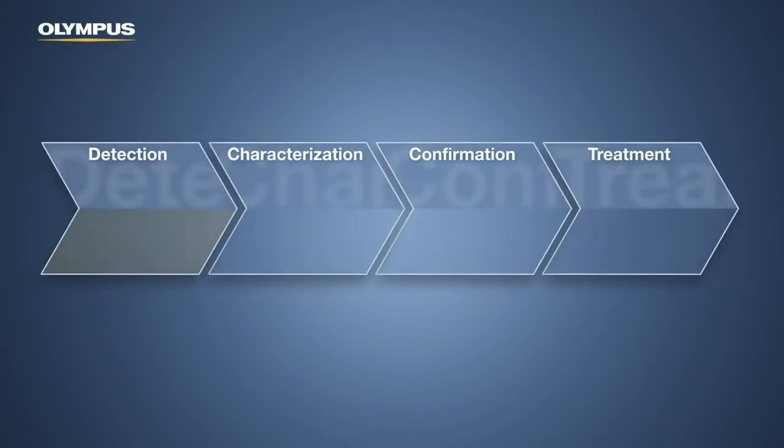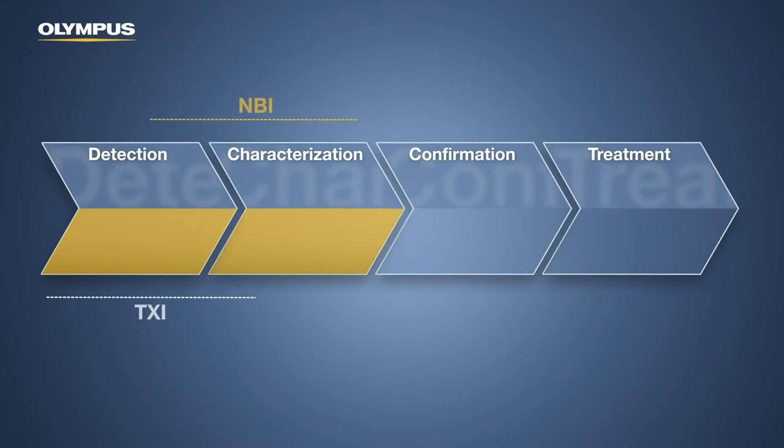During endoscopic observations, NBI enhances the visibility of superficial vessels.